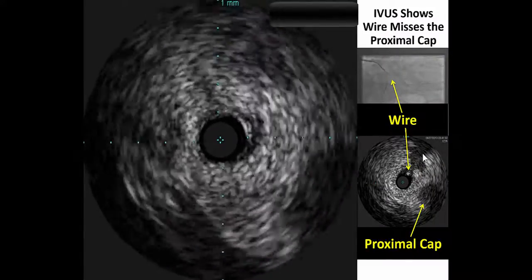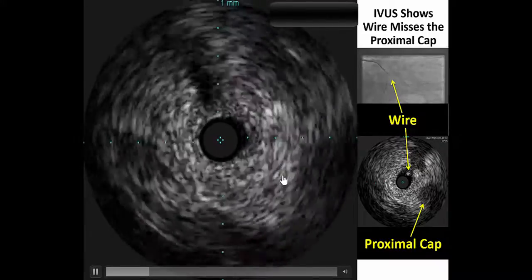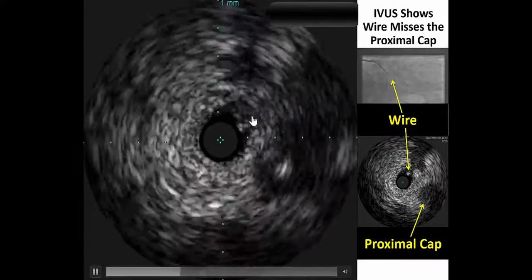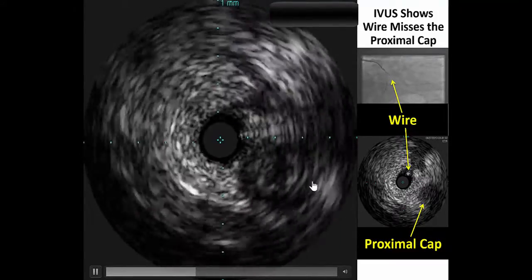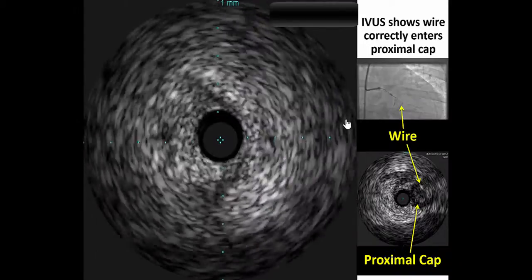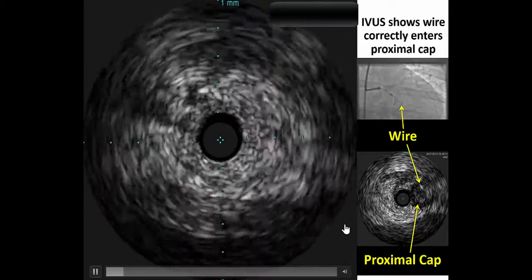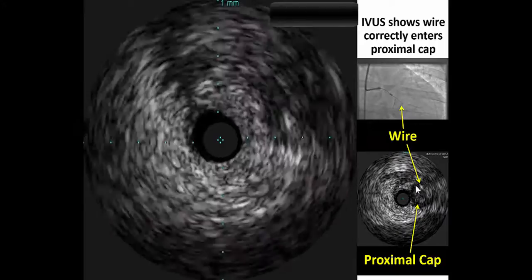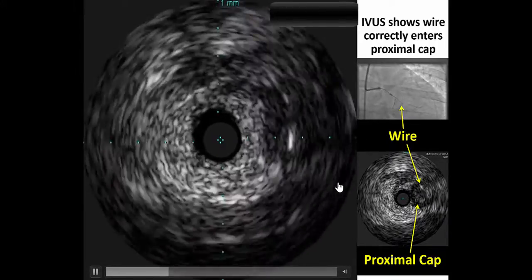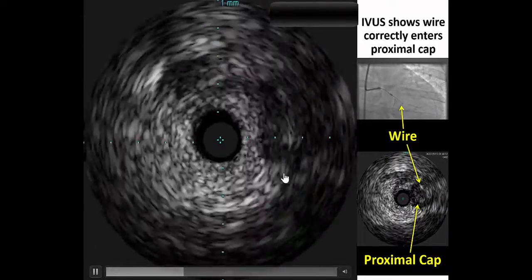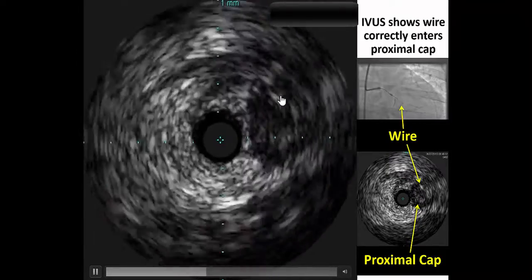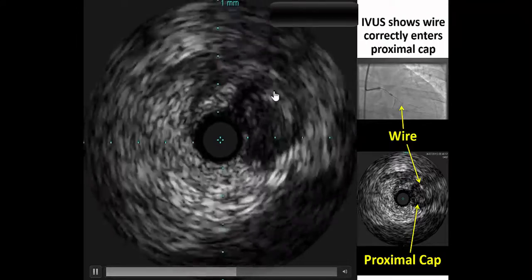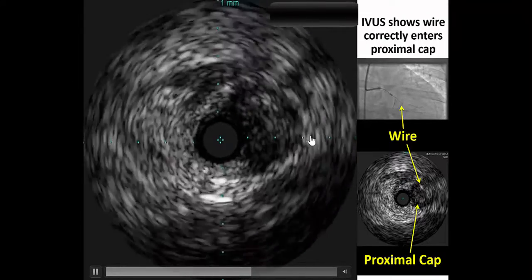We started once again with wire escalation and inserted the guide wire. However, with IVUS, it's clear that the wire is not actually engaging the CTO vessel — instead it's in a different plane. The wire was repositioned and IVUS was repeated. This time we do see that the guide wire is actually located within the vessel structure. This is the guide wire with the shadowing behind it, and it is inside the occluded vessel.